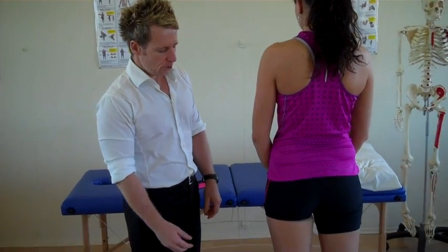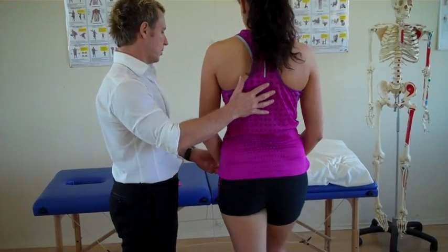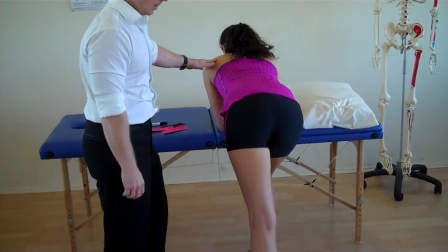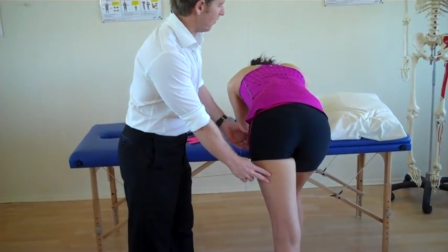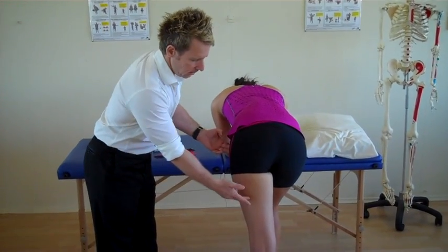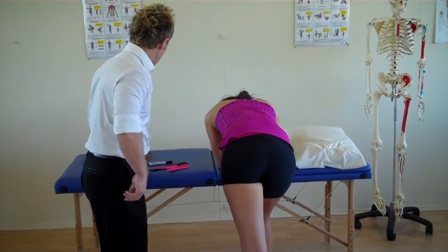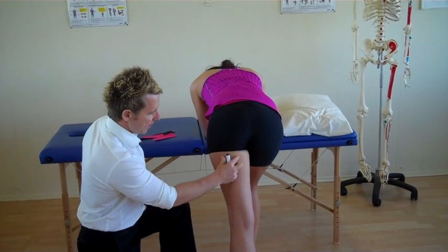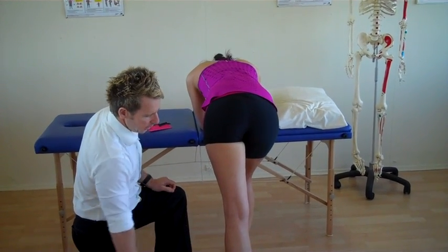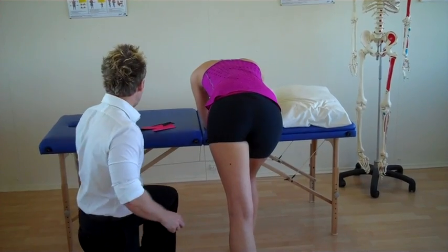First of all, we have to put the tissue that we're going to treat onto a stretch. So if I get you just a step forward and lean until we feel a bit of a stretch on that outer part of the hamstring, the person might have to flex a little bit just to initiate a lengthening of the hamstring. Think about the origin at the ischial tuberosity. The bicep femoris comes down onto the head of the fibula. So imagine that a person has some pain on the lateral side.